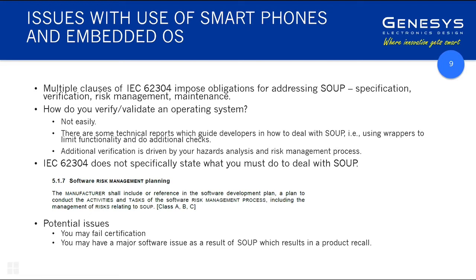Well, there are a few points there. When I say not easily, that's because with an operating system, there's a lot of software behind it, and verifying it is virtually impossible. Validating it may be a little more achievable, on the basis that you can do some additional risk management and hazard analysis and see that the end result does meet the user needs.